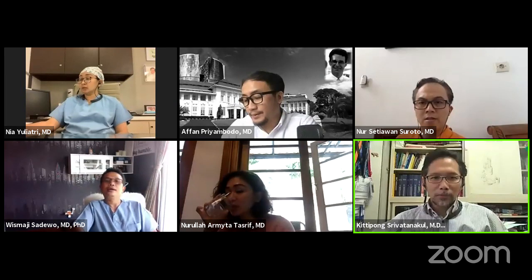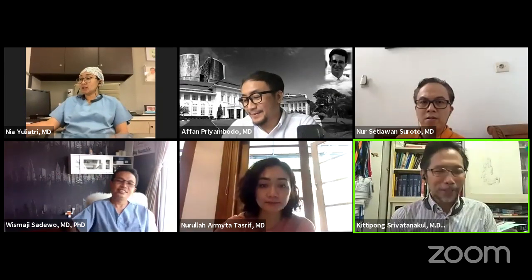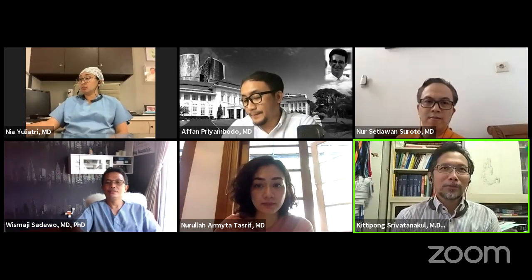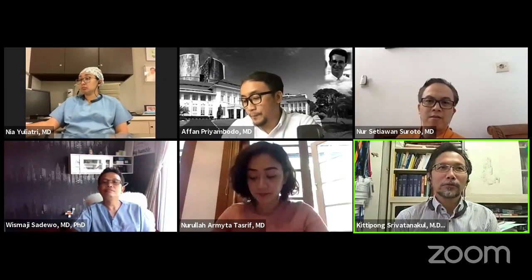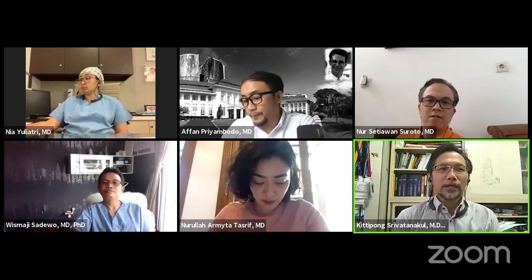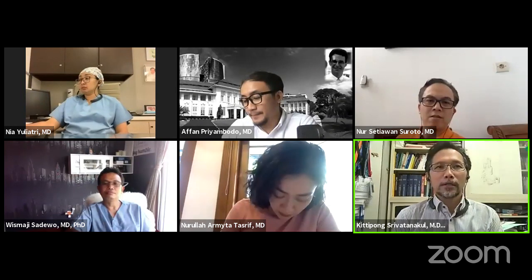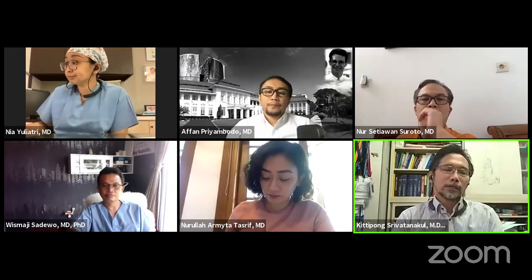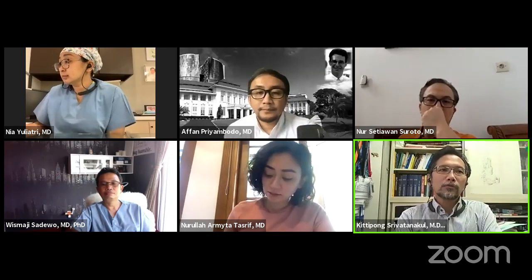Yeah, we finished with a very difficult question, which brings us maybe to the next discussion. Maybe there's probably no absolutely safe way to avoid a problem. People say if you use larger particles, you cannot enter the vasa nervorum, so you cannot damage the cranial nerves. That is most of the time very true.